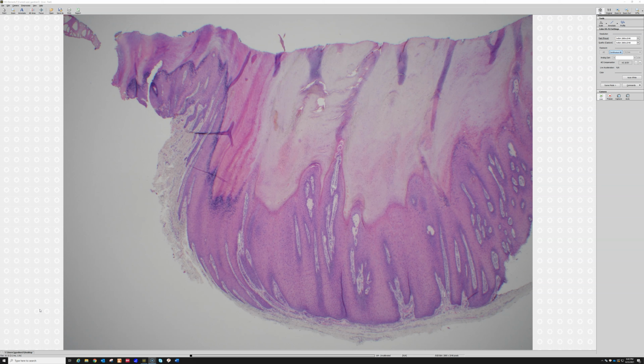And plantar warts are often endophytic, like this, pushed way down. I don't know exactly why it is, but I like to imagine it's from walking on it all day long, it continues to press the wart deeper and deeper down into the dermis, but the wart keeps trying to grow back up. So you have this cup way down, and then these finger-like projections sitting in the middle of the cup or the bowl.